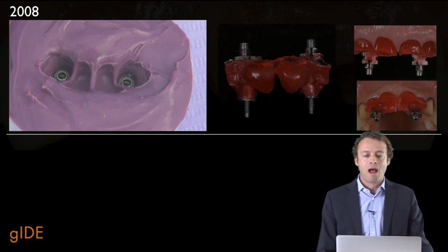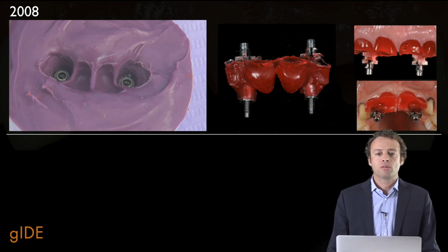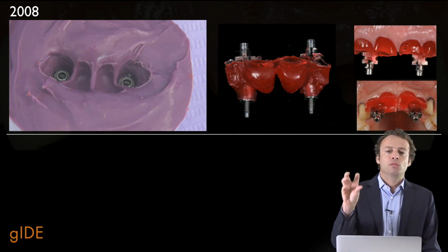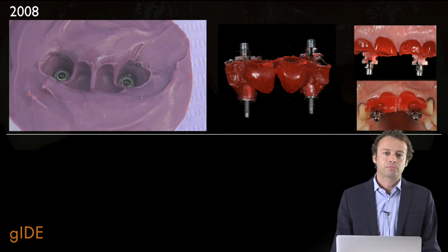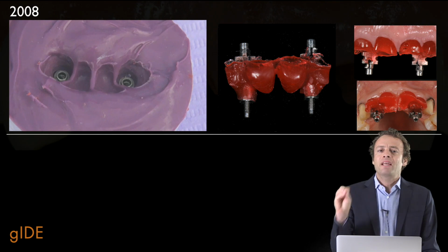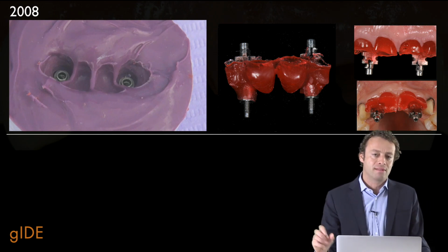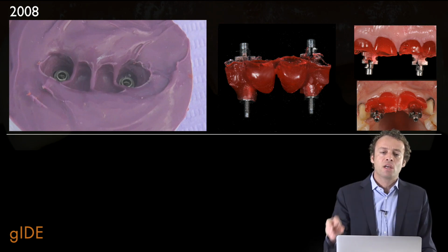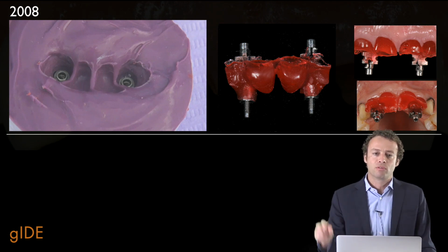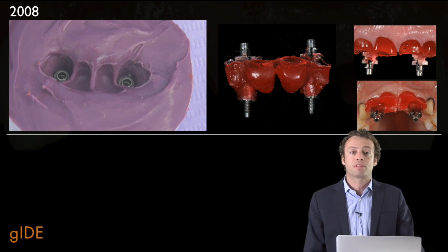So in that way, when I go into the mouth and screw in this key, it will be able to support the soft tissues in exactly the same way as the temporary. So I will maintain the soft tissues in the same way that I tested in the mouth for months. And this is really a crucial aspect. This is really an important secret in order to achieve a stable result in terms of soft tissue morphology and, of course, also soft tissue stability.